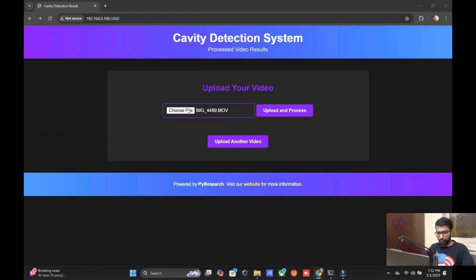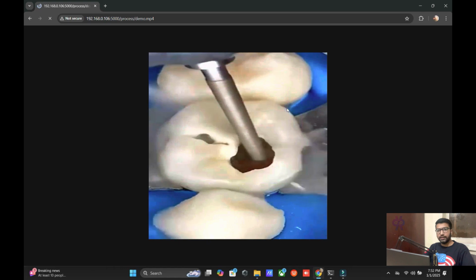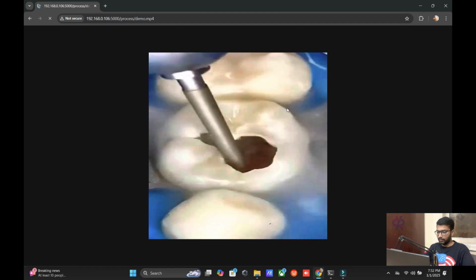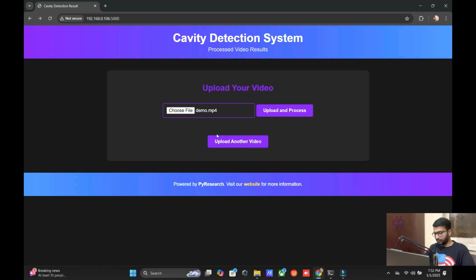Choose your demo and upload it. So you can see that cavity detection very clearly. We input the two videos and get the output as cavity. So it's a very simple cavity detection system for analyzing the teeth. Let's start from scratch without wasting time.